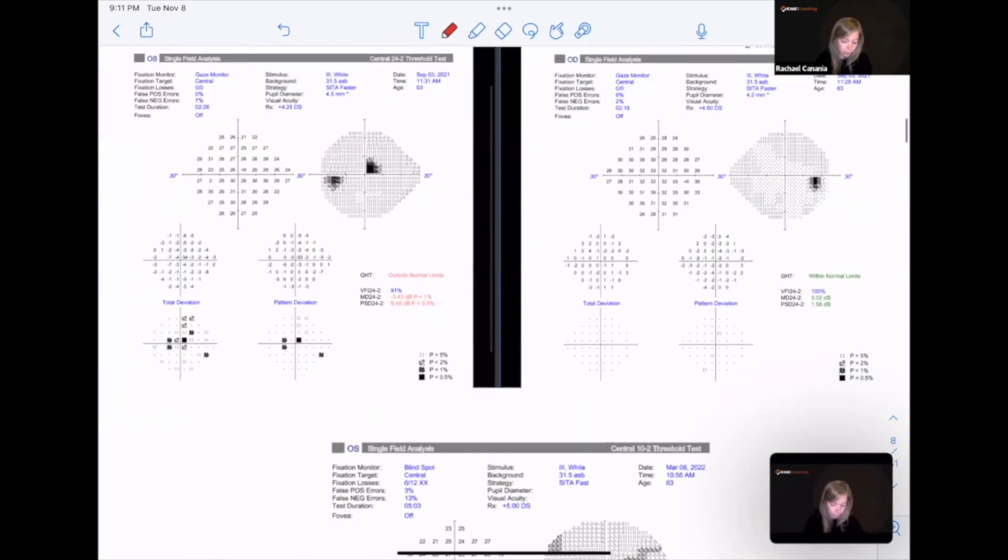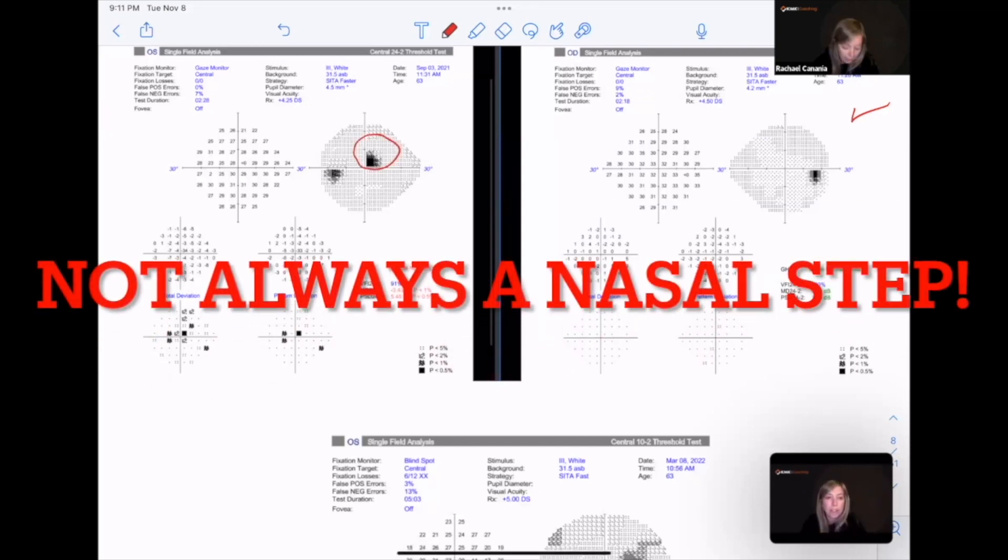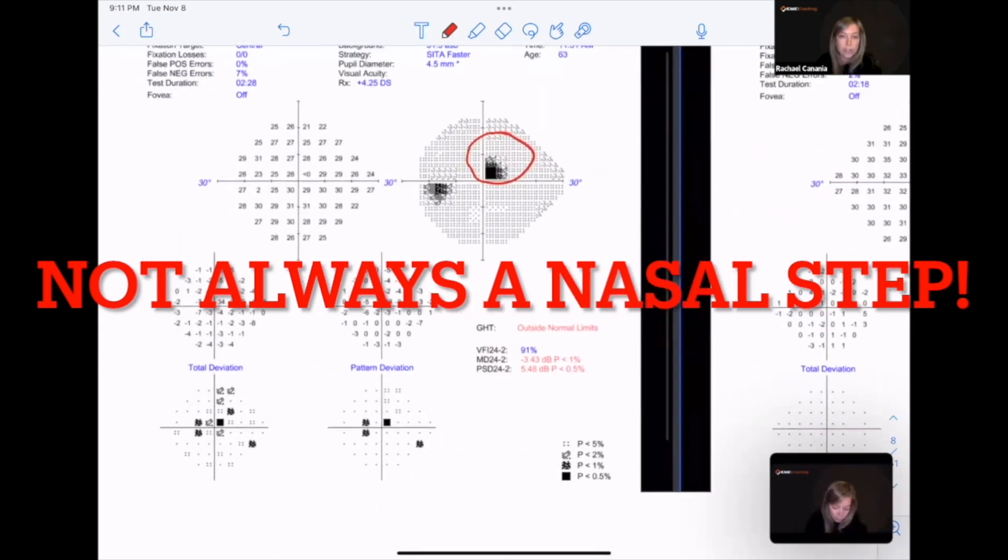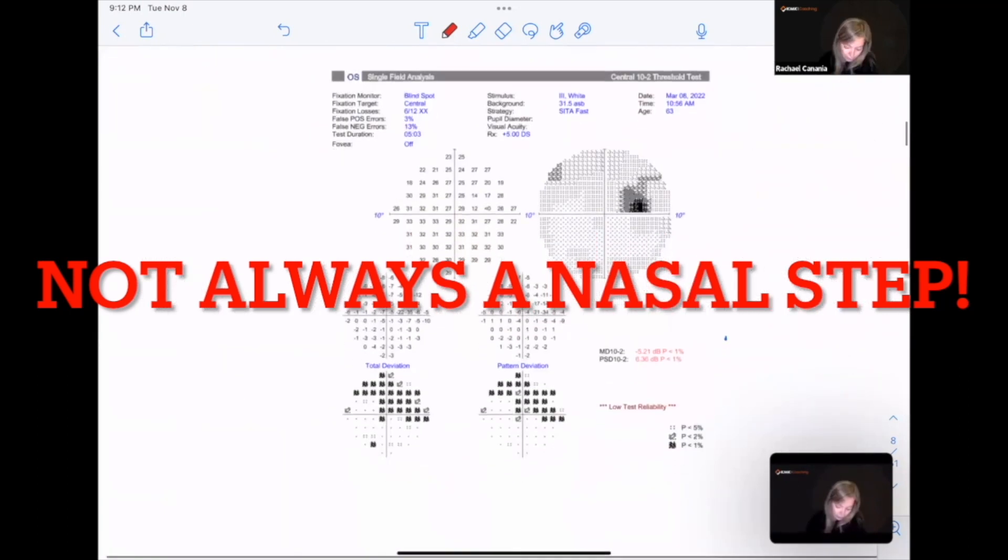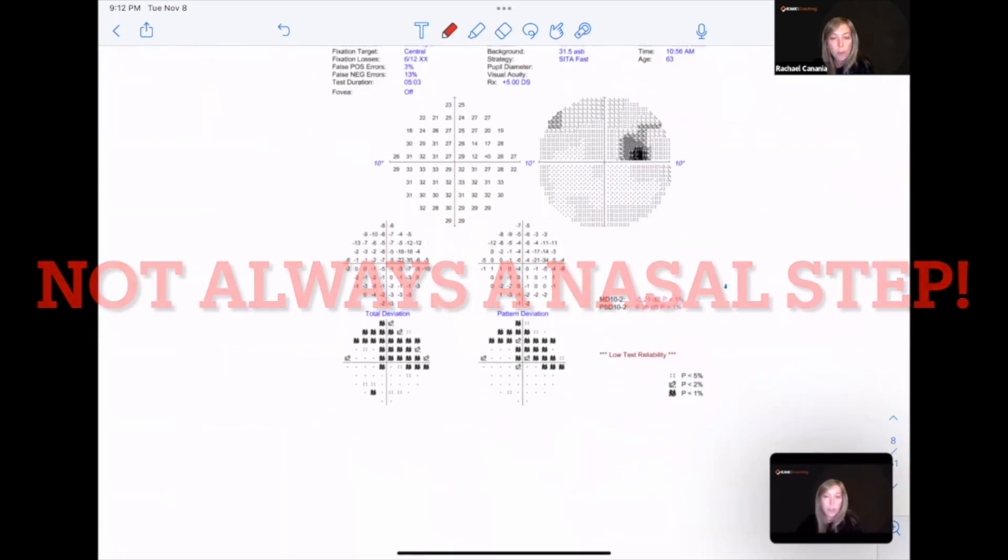Here's his field. The right eye looks great. The left eye has superior nasal loss and it's really close to fixation. Here's a 10-2. Look at how much blown up this defect is on the 10-2.